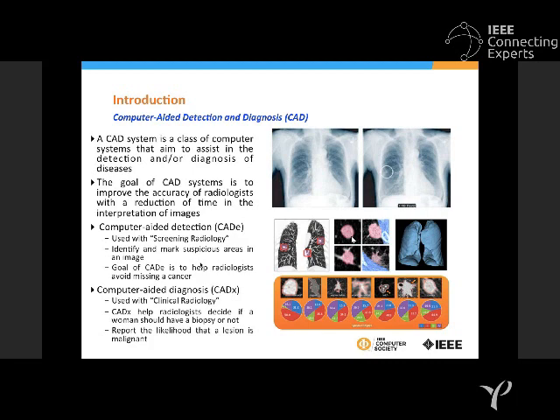It is doing a sort of classification, which means that if we have a good number of data set labeled by our doctor, I can train my system, I can train my network to understand the class levels in the best way. Obviously, feature extraction and pattern recognition will be the underlying phenomenon of how they are doing it, but ultimately they will be classifying, or doing a sort of risk prediction of these particular image samples, and that will give a sort of secondary vision to the doctor.